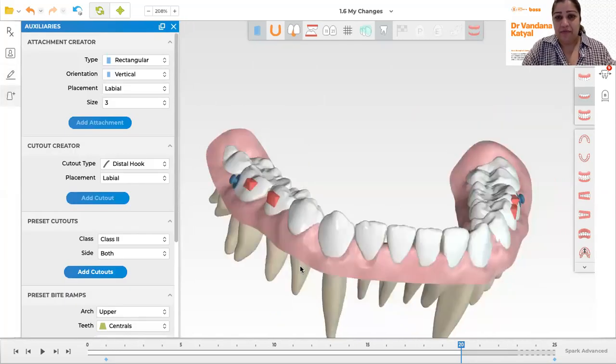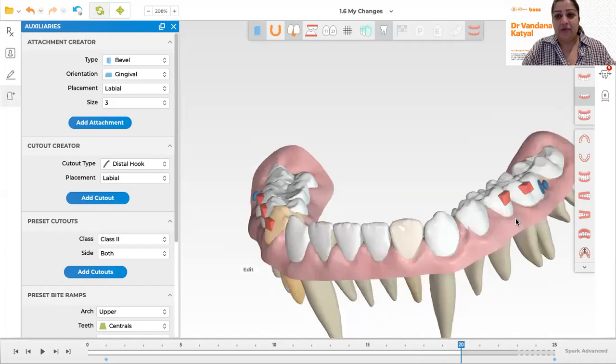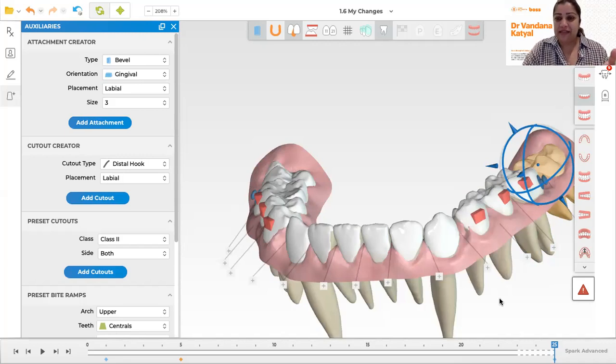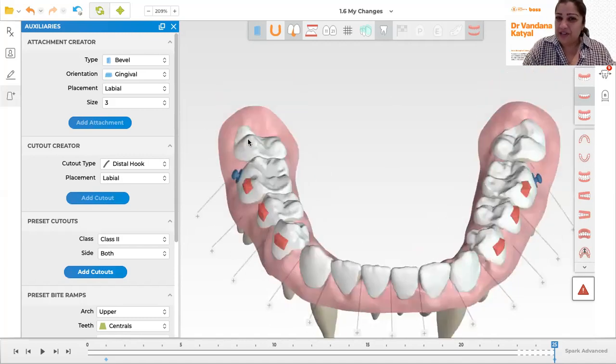I'm going to go into the module to add an attachment. I'd like a gingivally beveled one, so I'm going to pick my attachment with the bevel to the gingival and click on the tooth to add it. I'm happy with the position and I'd add a similar one on the other side, partly because we are extruding these teeth. I also think I'd like to extrude the six a little bit more, so I double-click the tooth and lift it up. The lower seven has no attachment, but we can still extrude it because it is actually still erupting — so simply adding that eruption to your plan knowing it will happen even without an attachment can help you.